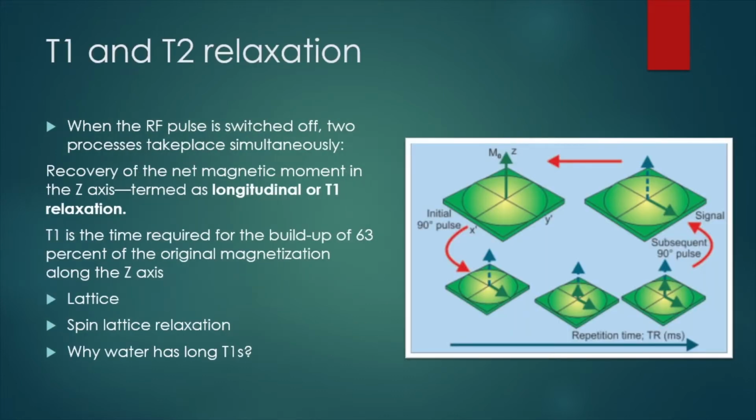So now I'm going to explain the T1 and T2 relaxation. Hello.